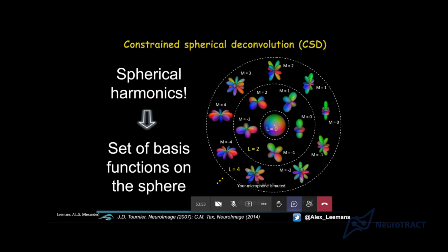So these are parameter settings. And remember the overfitting, right? There was a question about overfitting. Well, if you were to choose a degree which is too large, like instead of going to 4, 6, or 8, maybe 12, you might actually be starting to fit noise, right? So you don't want that either. You'll get artificial peaks and everything. We'll come back to that later.